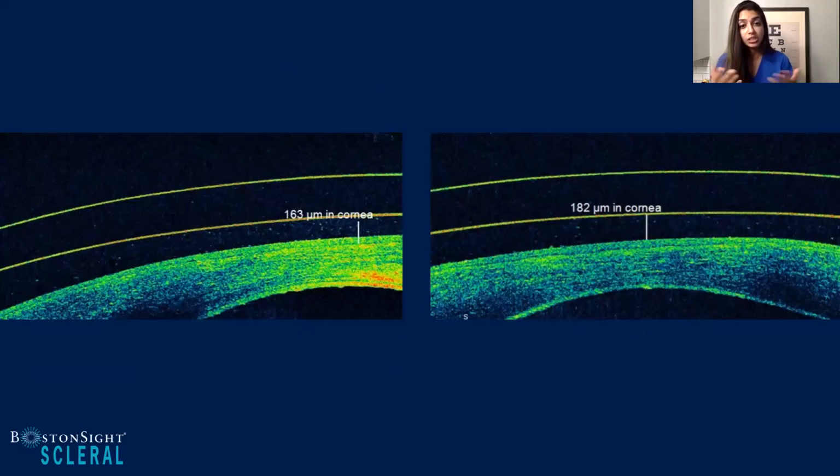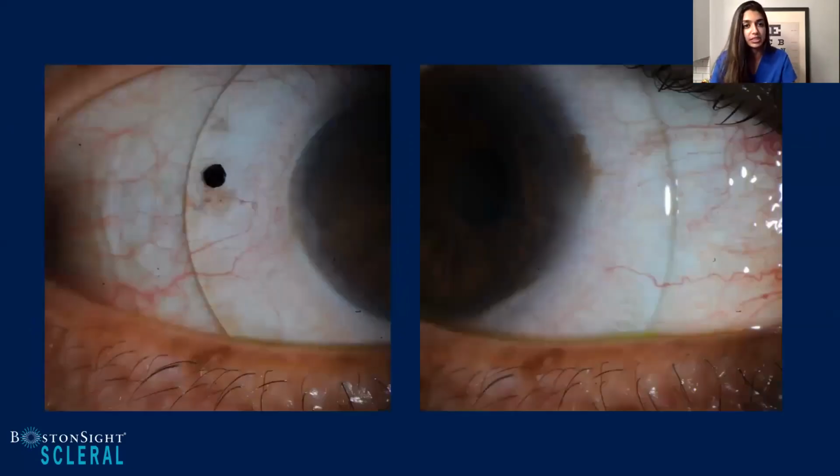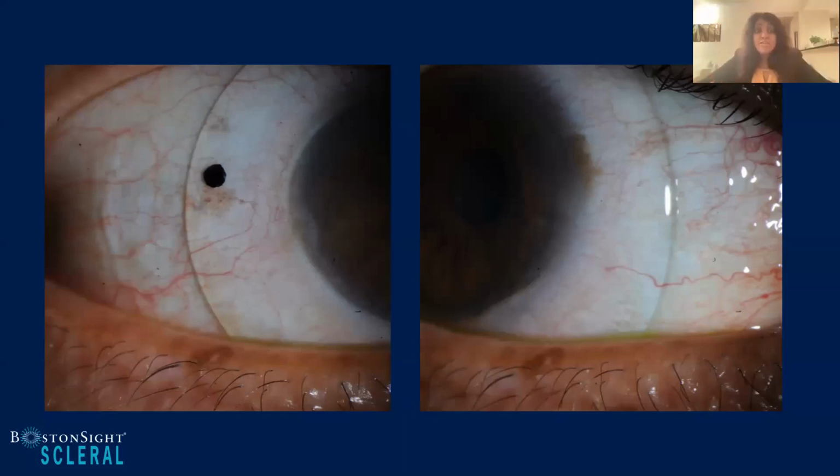And so really using OCT images, I looked at the central clearance, really nice low central clearance. I utilized a ruler to really determine how many microns I had. And then I was looking at the edges, and really these pictures are twofold benefits. I do want to draw everyone's attention to the fact that the patient did have some hybrid lens related neovascularization. So these photos were very, very important for me to monitor that neovascularization at the limbus. But when I look at these haptics, I don't know, Shalu, what do you think? How do they look? To me, looking at this, they look great.